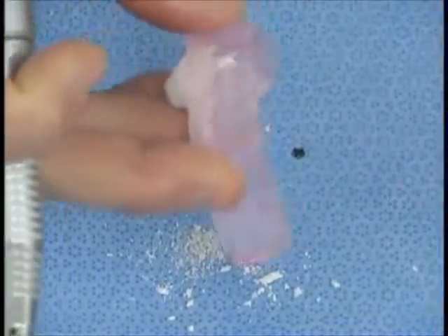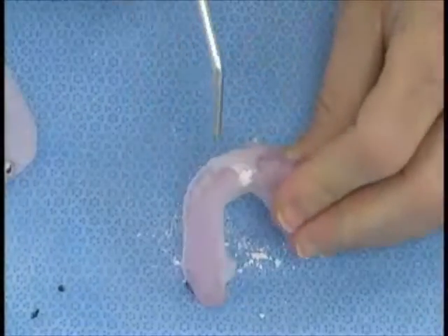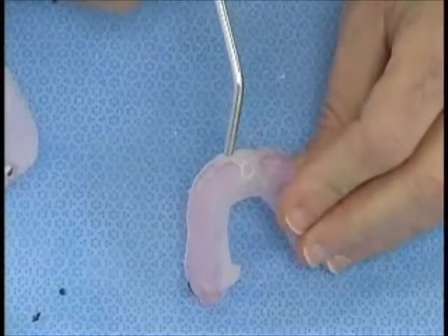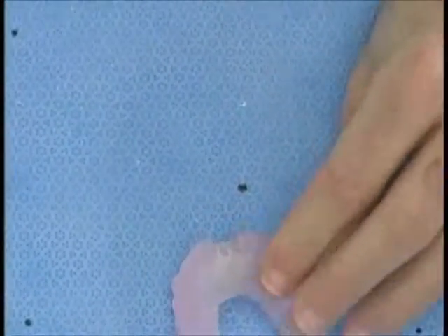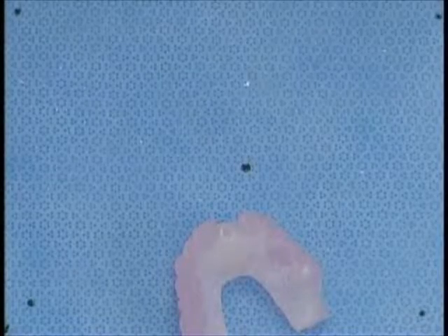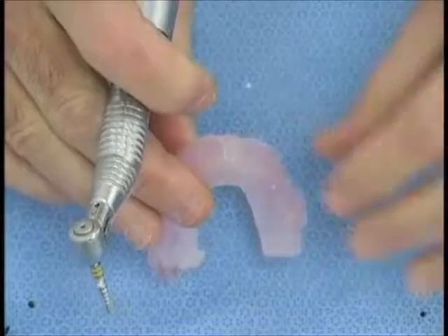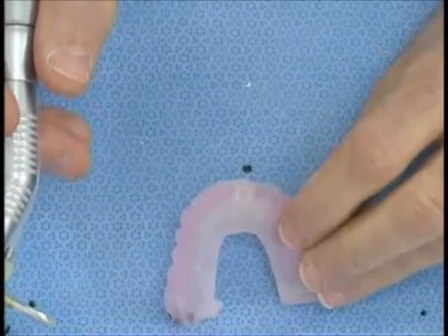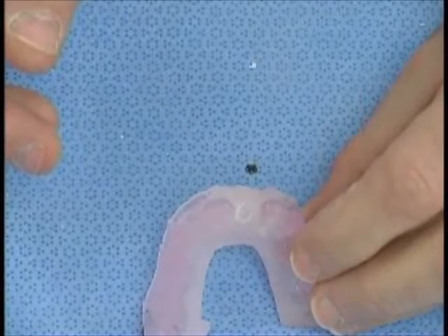Because this is an acrylic model, we want to actually drill a little bit looser, in the sense that we want to have a little bit wider osteotomy in order to fit our analog in there nice and easily. So that's something that we need to keep in mind in making this plan.